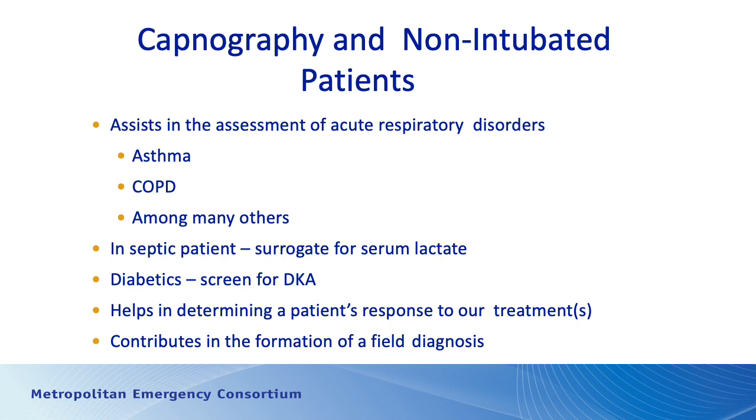We can use capnography in non-intubated patients to assess patients' response to treatments. I already mentioned asthma and COPD, but we can use capnography to indicate that the patient's improved. And then we can use it to help form a diagnosis in the field, or an impression in the field, of what may be going on with the patient.